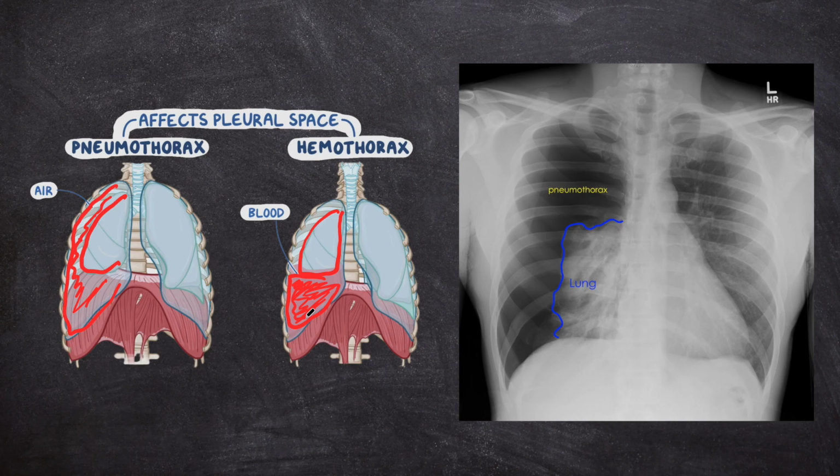So the image on the right is actually an x-ray of a pneumothorax. And if you notice, it's separated out nicely so you can see it. But look how much crisper and clearer, well, it's on the left, but it's actually the right side lung, because it's all inverted on an x-ray. So look at this side over here. Look at all this area. So this is a nice, crisp, clear, kind of blackened image.